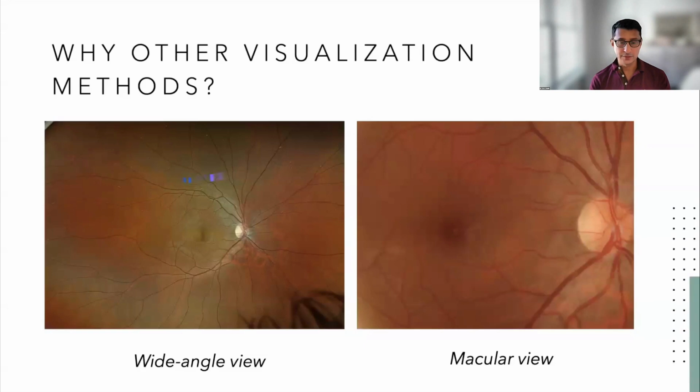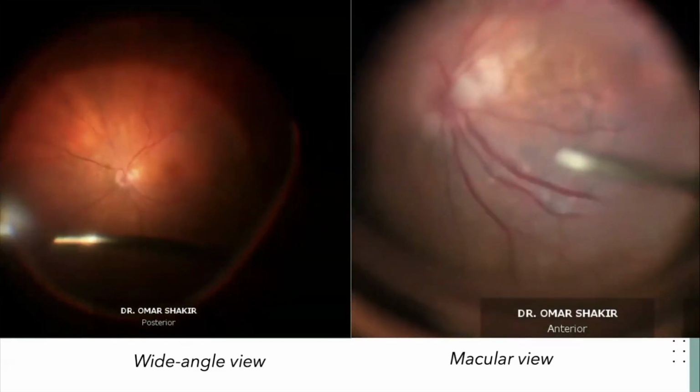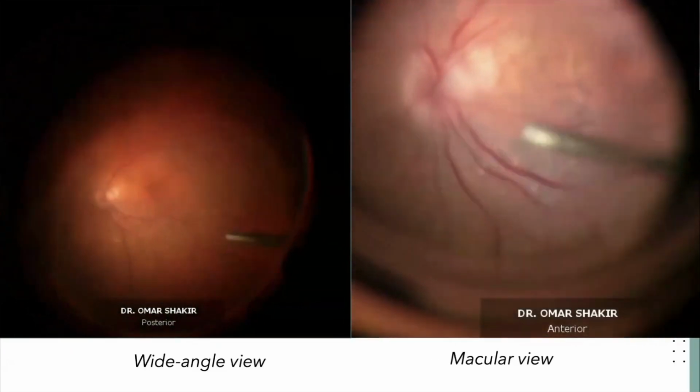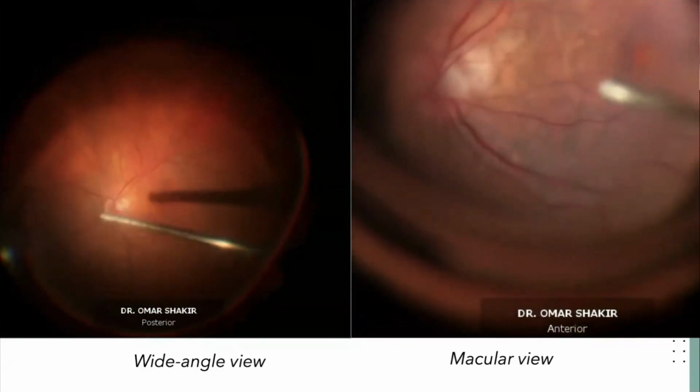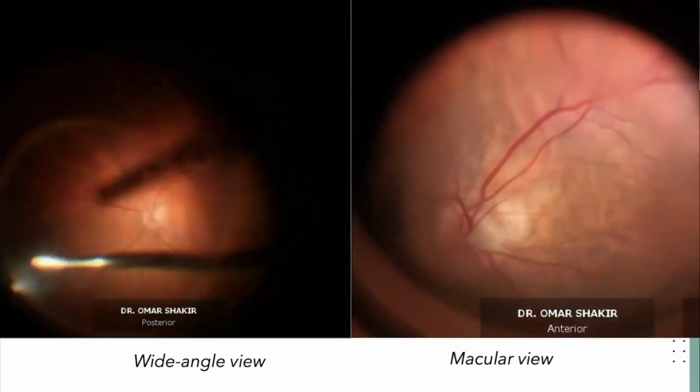So the macula gives you the zoomed in view of the optic nerve, blood vessels in the macula and the fovea itself. And then the wide angle field of view gives you a better view of the mid periphery. And then with dynamic viewing, meaning you move the image, you can start seeing into the periphery. So here's real world, left being a wide angle view and right being the macular view.